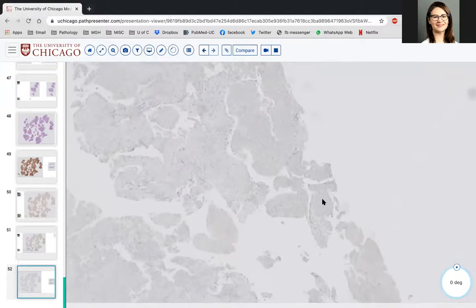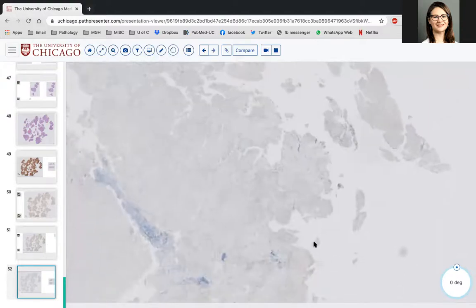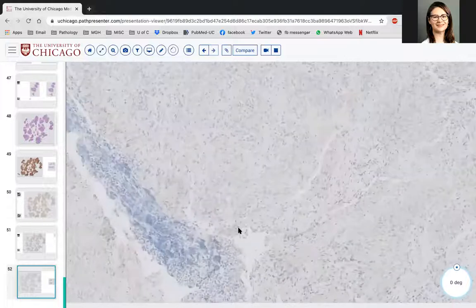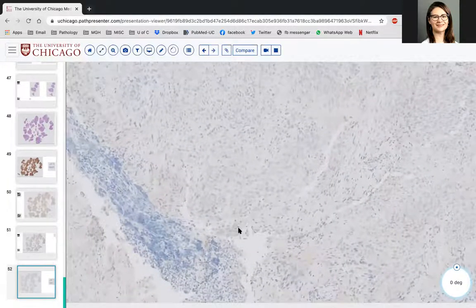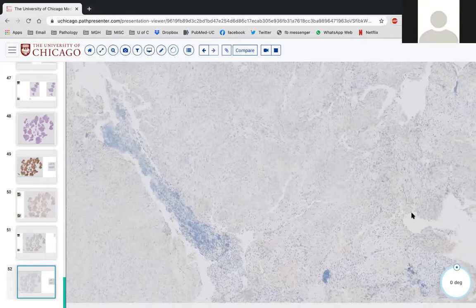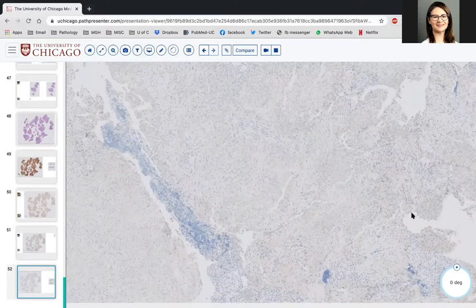But tissue preservation on core biopsy sometimes makes immunostains challenging to interpret. Weak, weird calponin made this challenging to interpret. But overall, diffuse strong SOX10 and S100 with hyalinized blood vessels and really no good EMA, and I believe radiographically a connection to the nerve, put this at a Schwannian tumor.